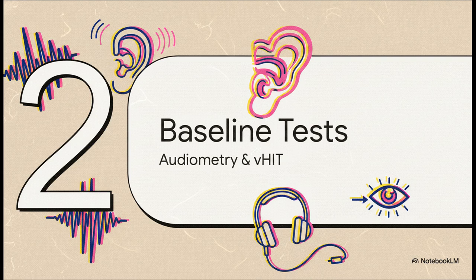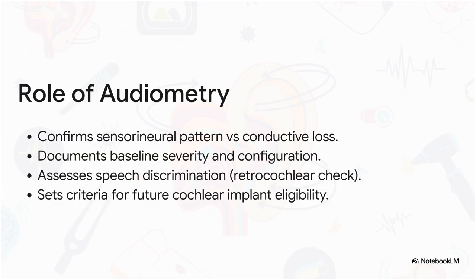Moving on to Section 2, Baseline Tests, specifically looking at audiometry and video head impulse testing. These two form the foundational pair of tests required for essentially all labyrinthitis presentations. Pure tone audiometry, or PTA, is absolutely mandatory. You really want to get this done within 48 hours of presentation if possible.